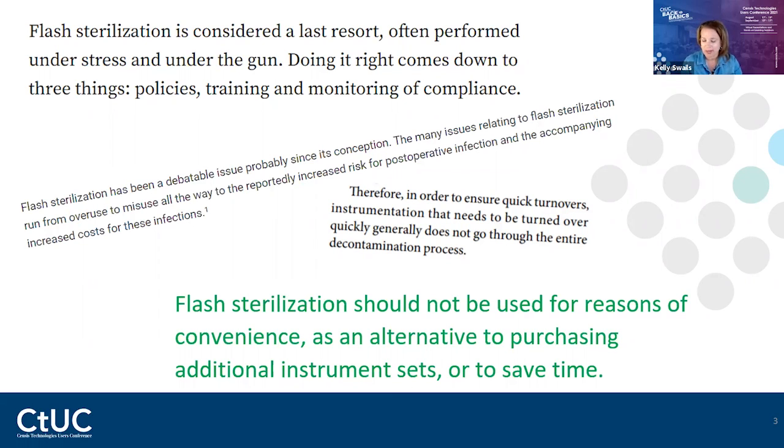When flash packs and other closed containers came on, they had to change that definition and wording, and that's where Immediate Use Steam Sterilization, or IUSS, came about. But again, I know I will slip and say flash, probably till the end of times.